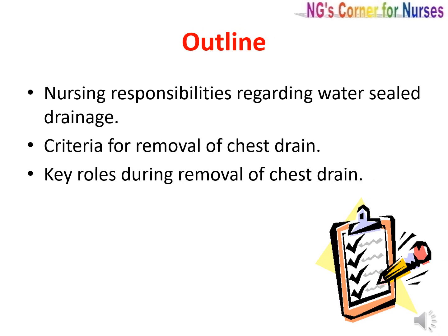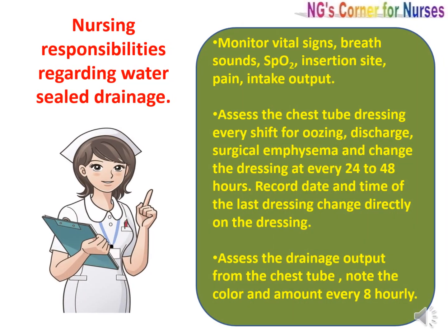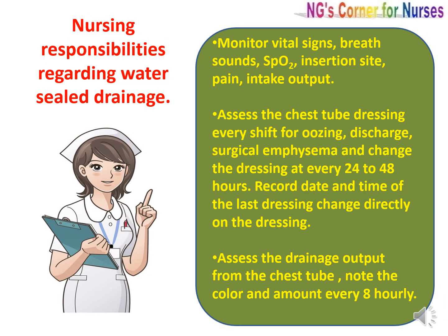In this video, we will cover the nursing responsibilities regarding water seal drainage, then the criteria for removal of chest drain and the key roles during removal of chest drain. Let's discuss the nursing responsibilities regarding water seal drainage.